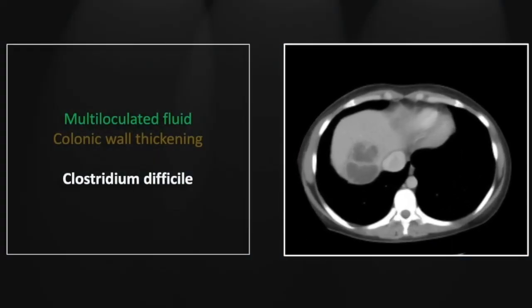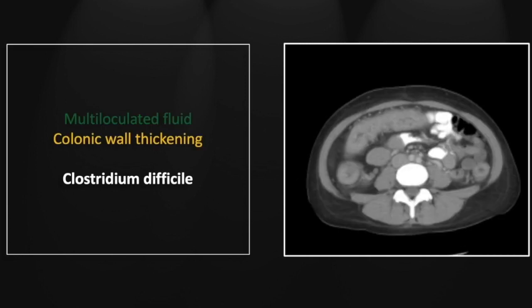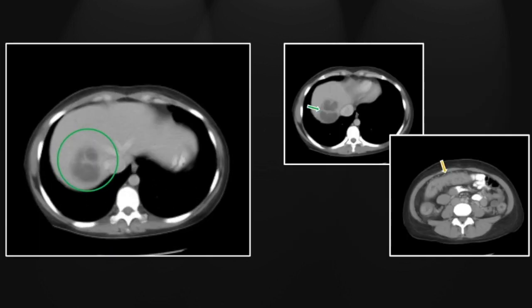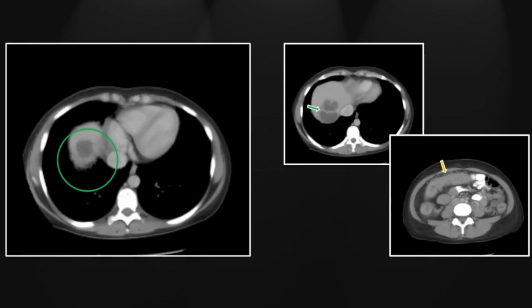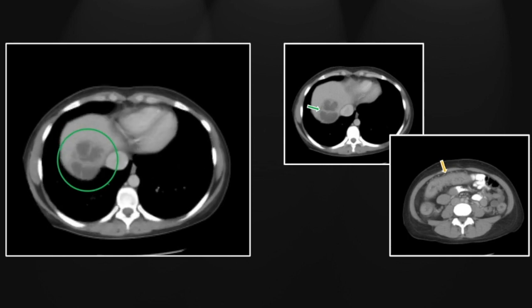Our next case is Clostridium difficile causing a hepatic abscess. This abscess is interesting in that it is multiloculated — on the cine you'll appreciate all the little loculations within there that are relatively well-circumscribed, and will certainly make you think of hydatid disease as a possibility. But lower in the abdomen, we are given another finding that helps us put this one all together: extensive pancolonic wall thickening highly suggestive of Clostridium difficile infection. Here is that multiloculated abscess — the kind of thing that might make you think of hydatid disease were it seen in isolation.